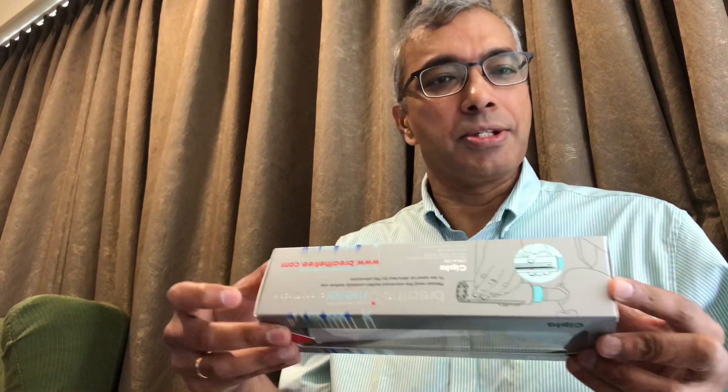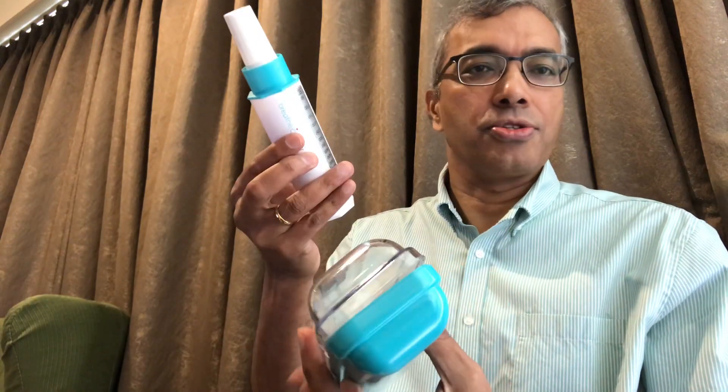Good day. I'm going to talk to you about a peak flow meter and why all our patients with asthma go home with one. This is a breathe-o-meter, and if I open up this little box it comes in a plastic container — this is your peak flow meter. This is like a thermometer for asthma. It's a monitoring tool.